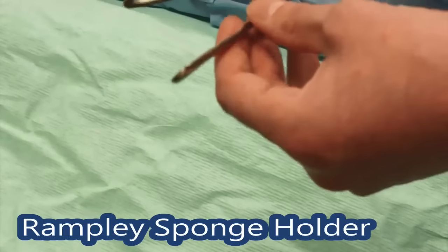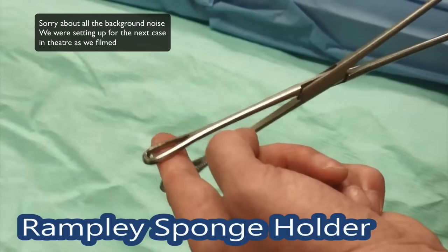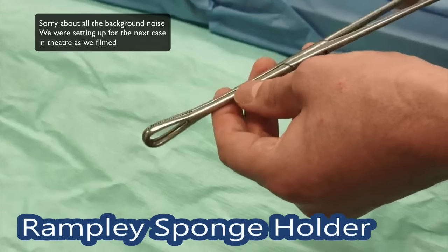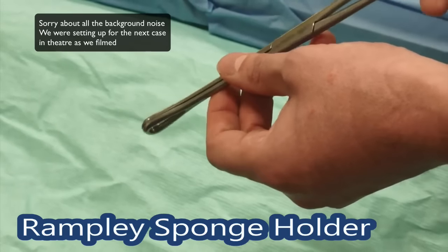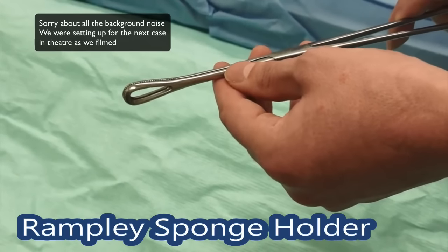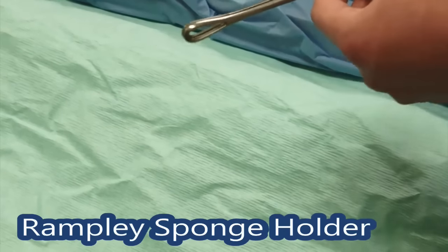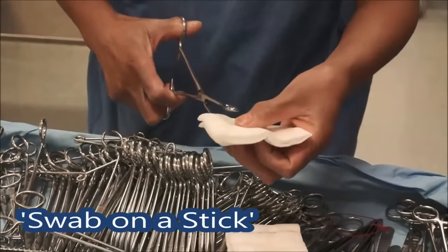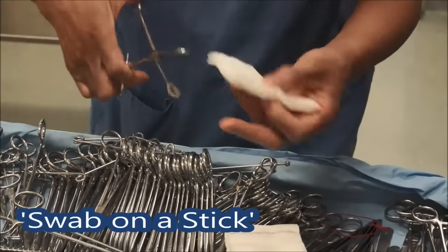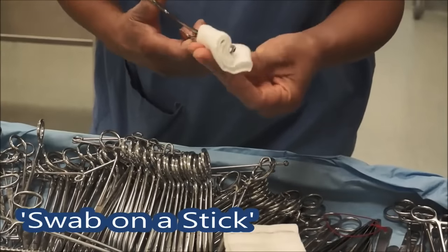Sponge holding forceps — you've got some nice large round paddles on the end with some teeth, it's reasonably soft. You can use it just as it is to retract the gallbladder in an open gallbladder operation, though they're not done very much anymore. The other thing it's more usually used for is to put a swab on a stick. June's going to show us how we mount the swab. She's got a small Raytex swab here, catching it in between the sponge holder.